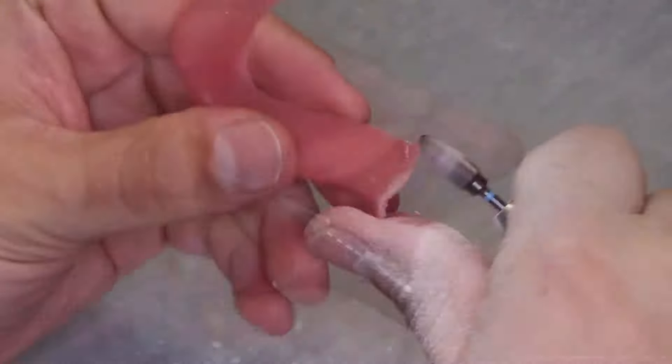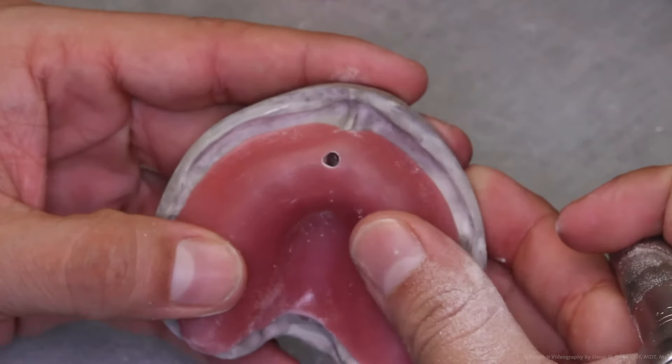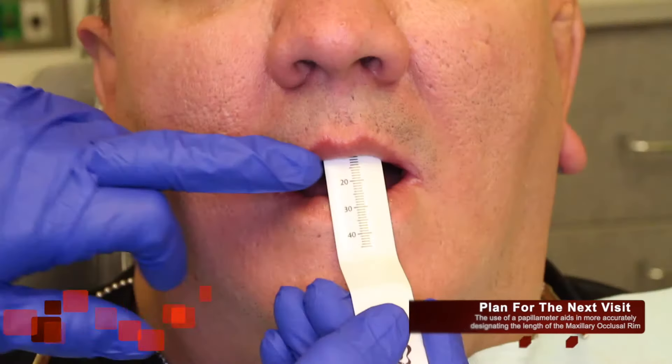The final step of smoothing should be performed with a fine carbide burr. Tapered carbides will aid in finishing hard-to-reach areas like the frenums. The incisive papilla is a very important landmark when it comes to setting teeth. Locating the incisive papilla will aid in the proper positioning of the maxillary centrals, which can be estimated to be about five to seven millimeters in front of the papilla. Cutting a hole in the base plate will allow you to view the incisive papilla during the process of setting teeth.